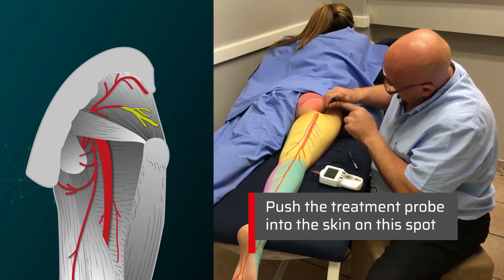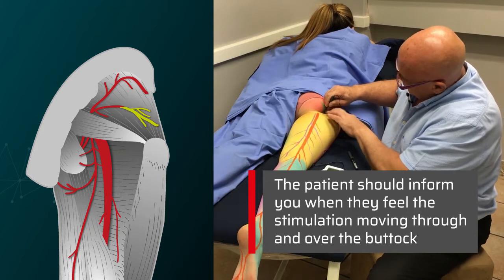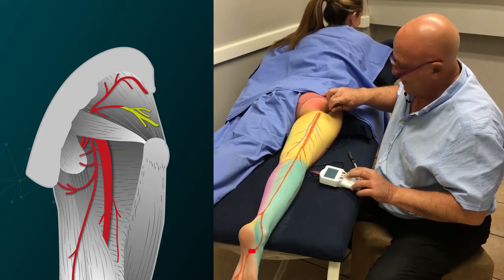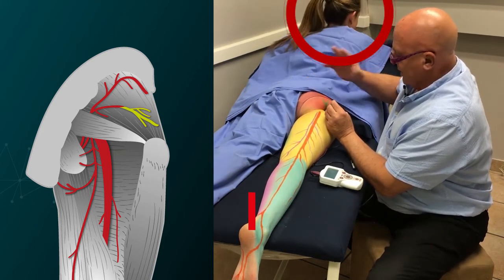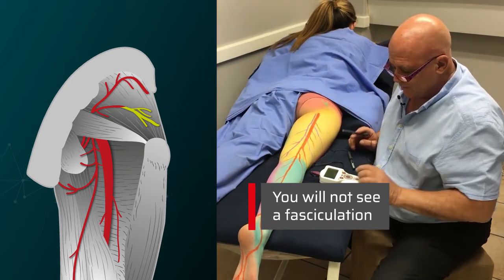Notice you can push the probe in, because as we spoke about earlier, the ideal therapy requires the shortest distance from the probe to the nerve. She's acknowledging she's feeling it up on her butt. Then we can treat that nerve if she has a problem in her butt.